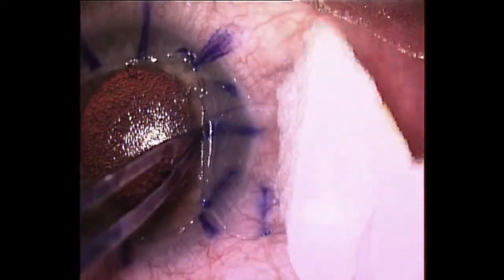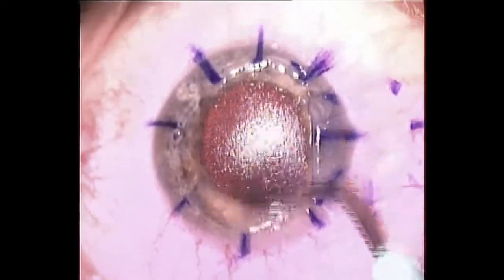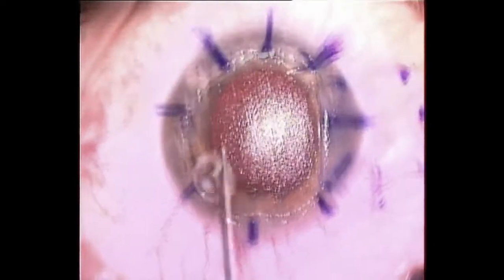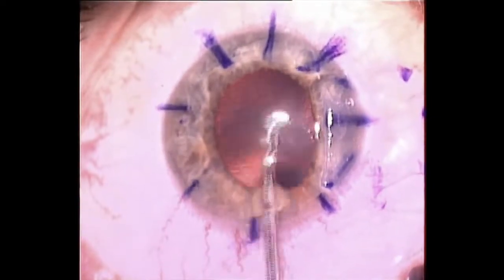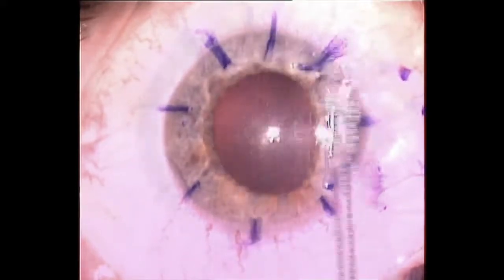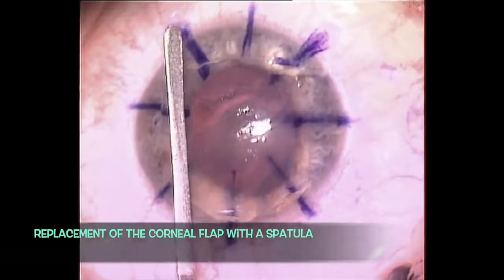And you will see now how we are irrigating both surfaces with distilled water. Remember, distilled water has to be used because of the osmotic stress that it creates on the epithelial cells, and it also allows not only the detachment of the cells, but to eliminate the fibronectin pathway, that is the scaffold the cells use to invade the interface again. Once the hypotonic water has been used, then we can clean the interface. We replace the corneal flap with a spatula.